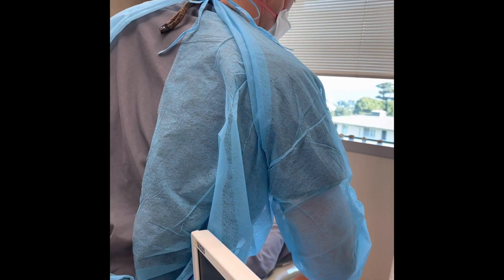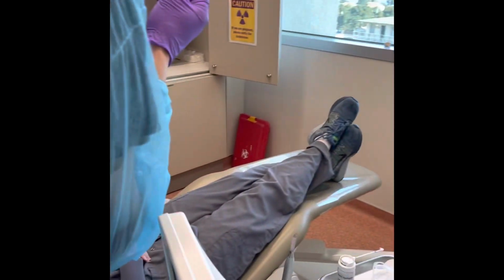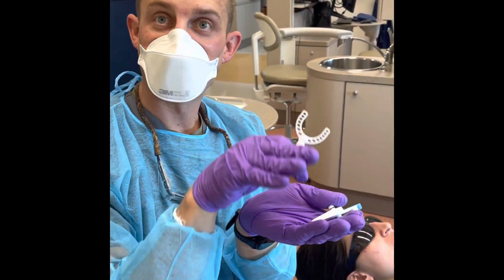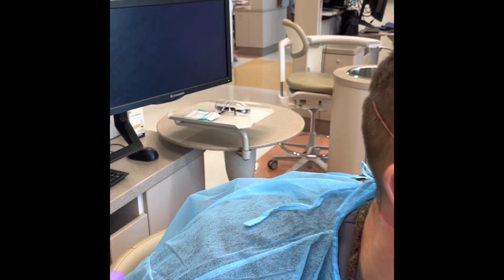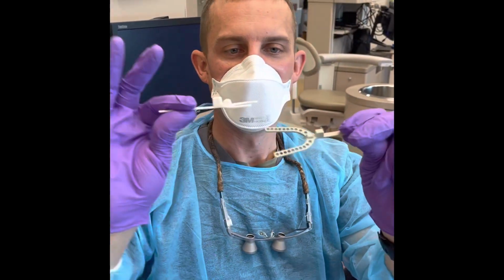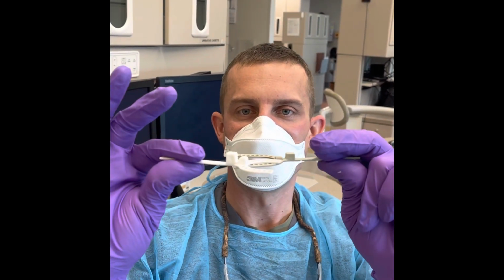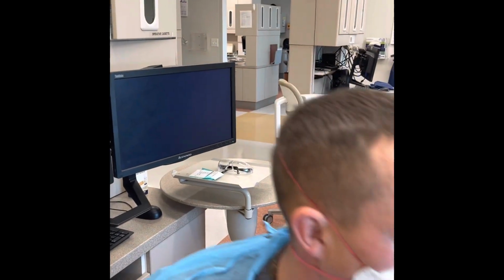I like to use the taller bite fork when we do these types of restorations. When we send to Prosomnus, the wider we have the jaw open, the less likely their virtual articulator is going to have a posterior interference. So if we can, we use the 5 millimeter bite fork as opposed to the 2 millimeter bite fork, which you can see is up in this incisor area here and here if you compare them side by side. So we're going to go ahead and put the 5 millimeter in.